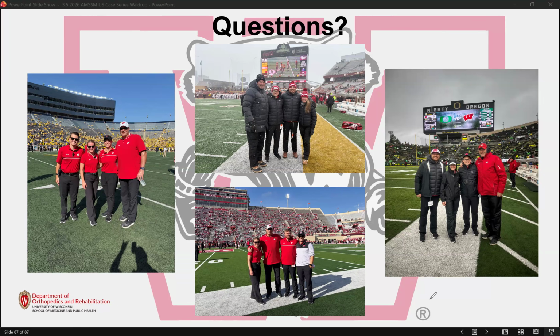The second thing I was going to mention is, you mentioned that ultrasound of the meniscus is pretty limited. There's actually a lot of really good research on ultrasound of the meniscus, so I'd encourage you to take a look at some of that, as far as the different signs that you can see that would suggest different meniscal pathologies within the knee. There's some pretty good rationale that this is a reasonable first step screening.